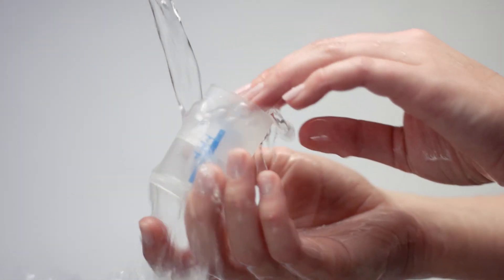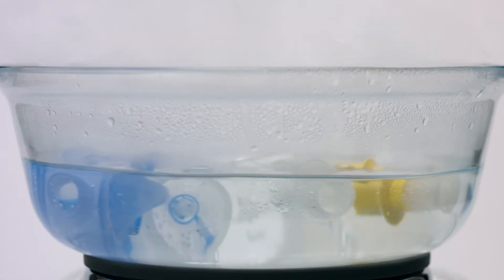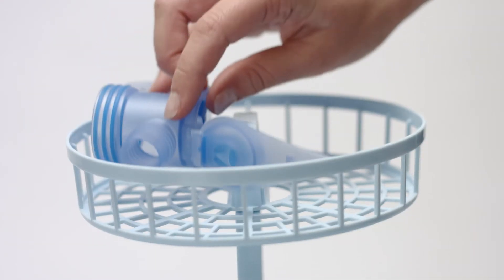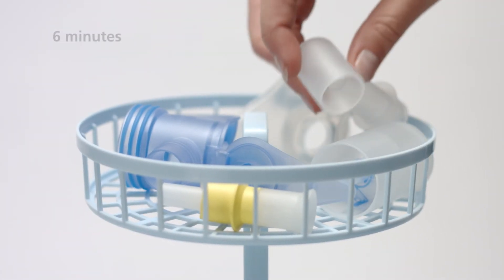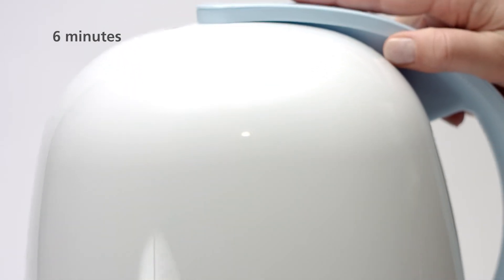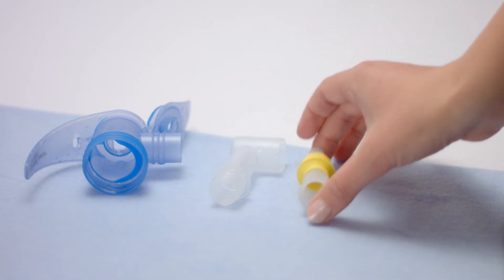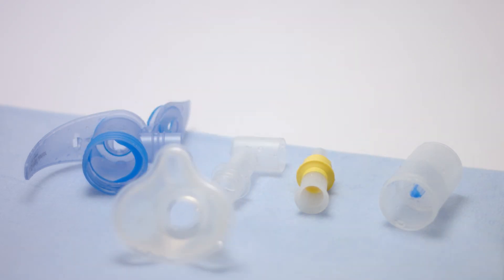Wash all parts in warm tap water with dishwashing liquid before rinsing thoroughly in running water. Once a day, disinfect the nebulizer by either boiling it for five minutes in water, or placing it in a standard thermal disinfector for baby bottles for at least six minutes. Once dry, store all parts of the nebulizer in a dry, dust-free place.